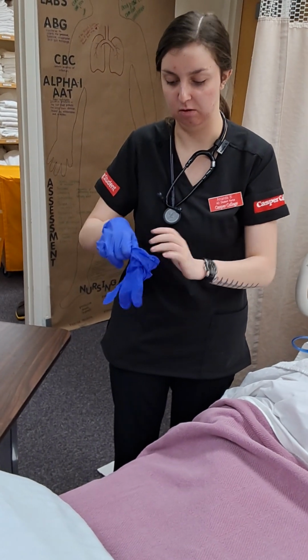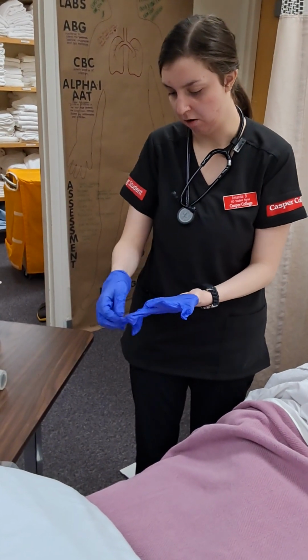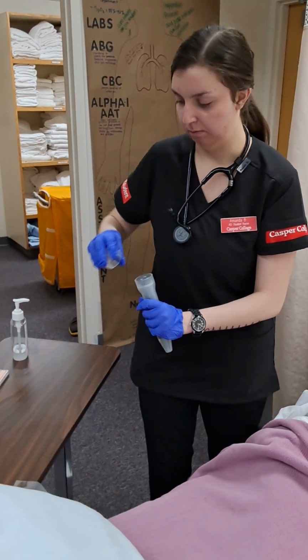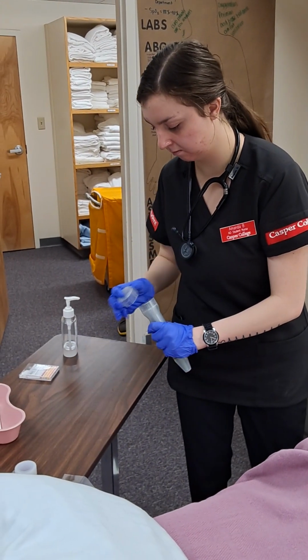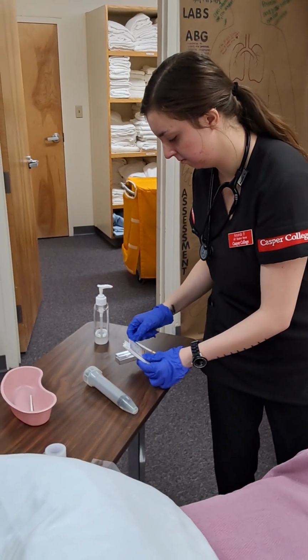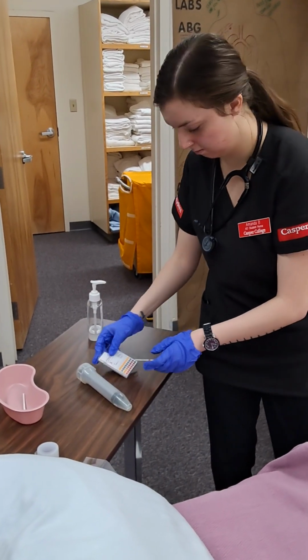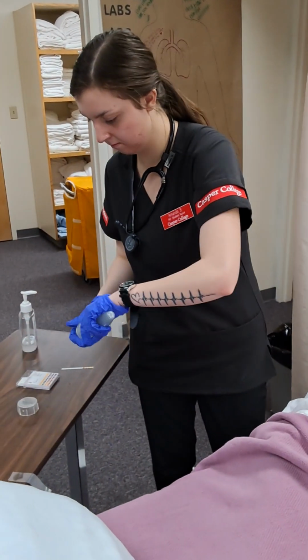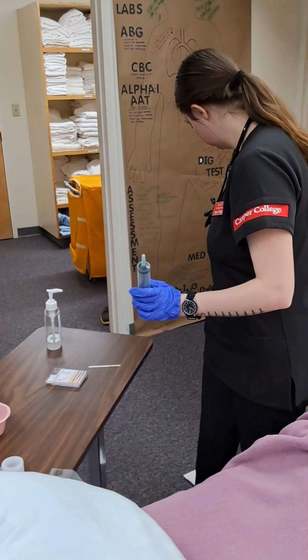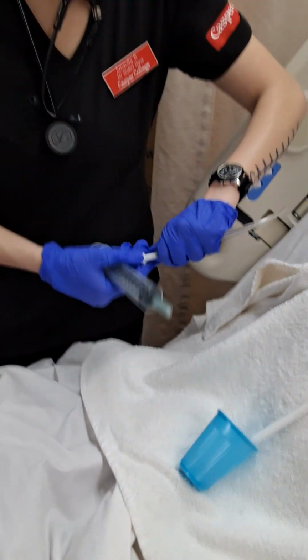And after the x-ray, I will attach him to the suction, only if the tubing is confirmed to be in the stomach. If not, it will be discarded. Will be removed. Okay. That's just going to go in the trash. Okay. Alright, I'm just going to aspirate the contents.